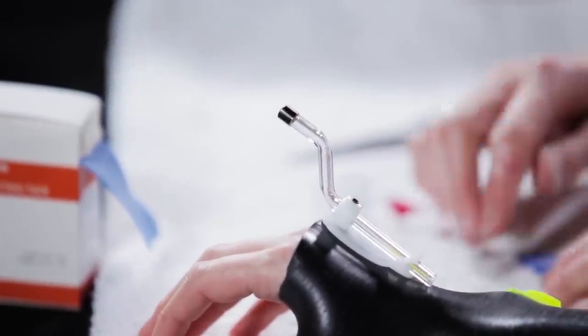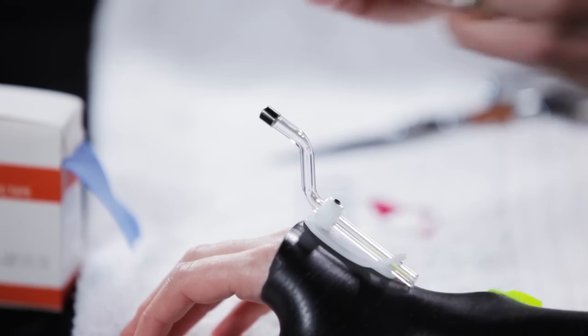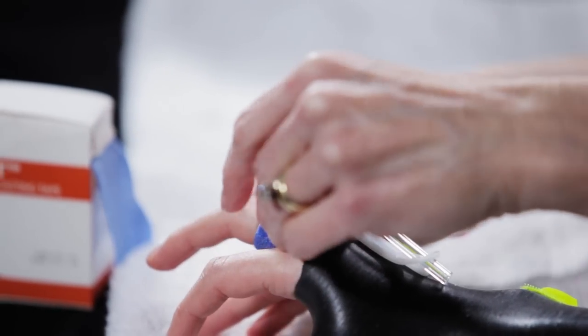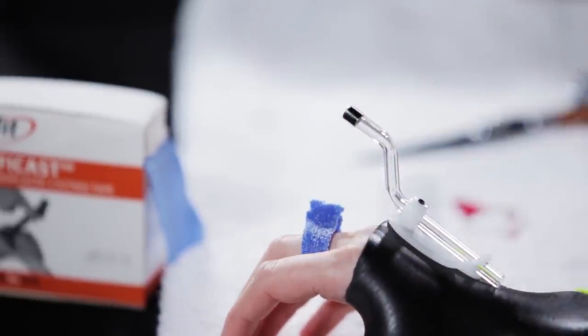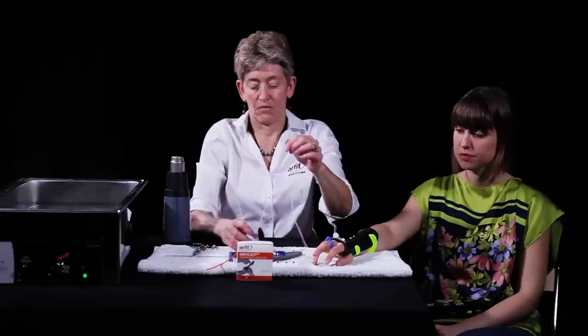Fold into half lengthwise. Place the OrphiCast underneath the proximal phalanx. Pinch together on top to form a ring which will be trimmed into a cuff.